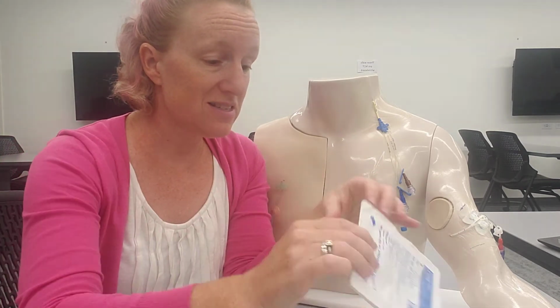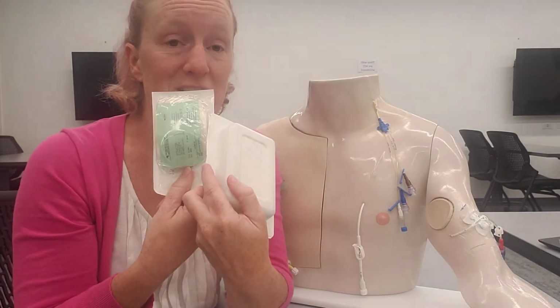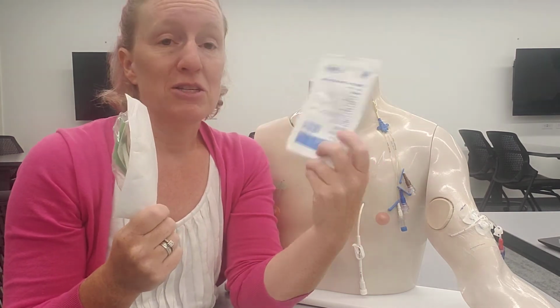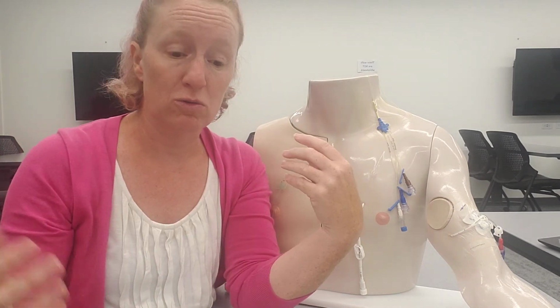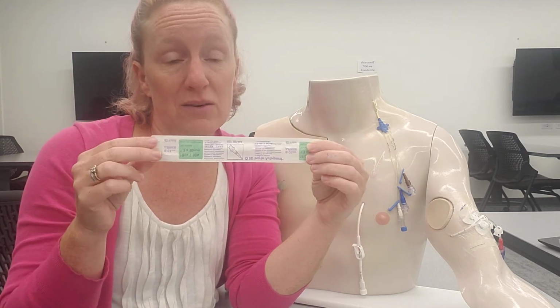When we're looking at supplies for IVs, every facility is going to have different supplies. This is an IV start kit, and this is an IV start kit. They both look different, but they both have the same things in them. Tegaderm, a tourniquet, some cleaning stuff. Your catheter, however, is going to be something that you get on your own at your own time, because again, you get to pick the size depending on the patient and depending on what's going on.